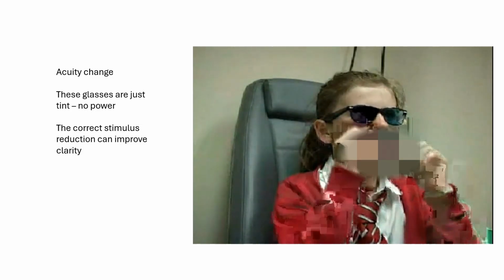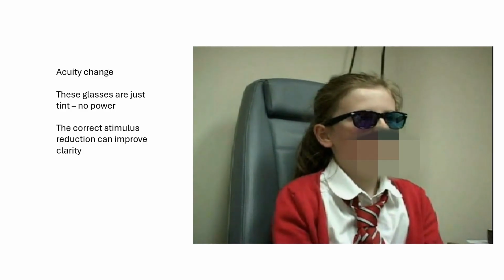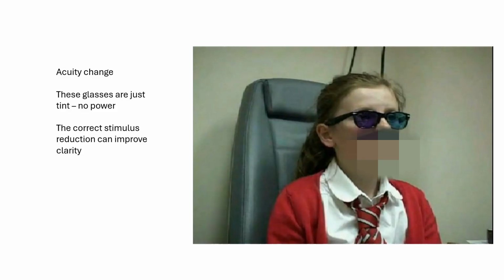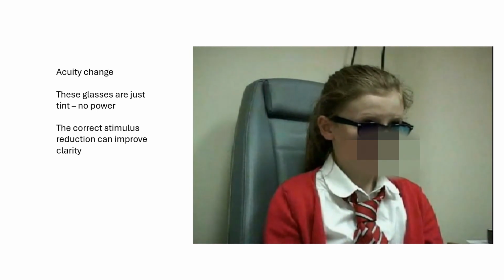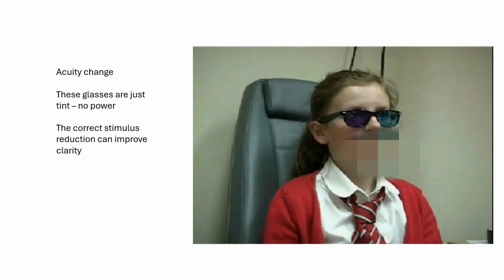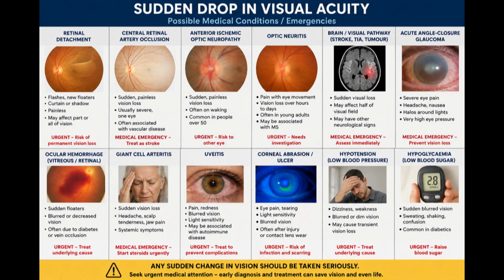First of all, what's the difference when you put the glasses on? Is there any difference in how clear the chart is? What's the difference? It's clearer. Is it a lot clearer or just a little bit? A lot clearer. Right, can you see the bottom line there with both eyes? When you take them off, what can you see? Nothing. Nothing on the bottom line. Can you see the next bottom line? Sort of. But it's the third bottom line that you can see, really. So there's two lines better with the specs. Okay, that's a start.